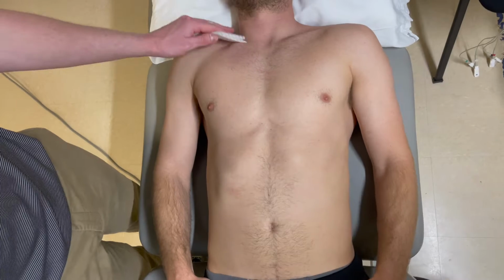Simply put, as the electrical activity of the heart moves towards an electrode, this will display a positive measurement, moving the ECG line upwards. Conversely, movement away from the electrodes provides a negative measurement, moving the ECG line downwards. Now that we understand the basics, let's move on to placing the electrodes on our patient.